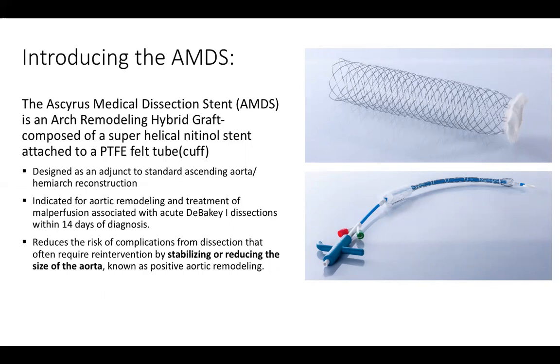And as I said before, it's really an arch remodeling hybrid stent graft. It's made of nitinol with this cuff at the end, which you sew, and I'll show you, hopefully the video will work.